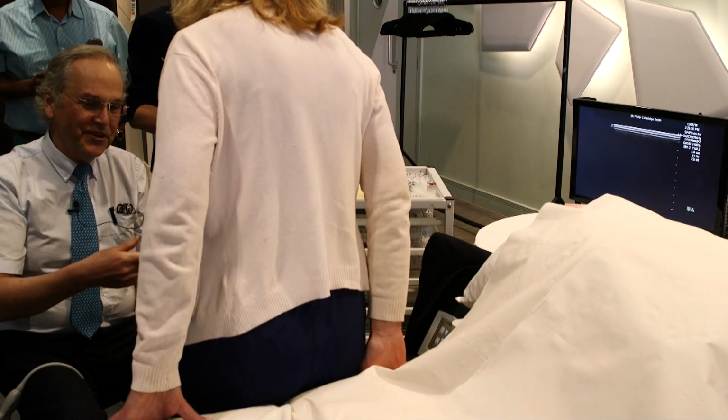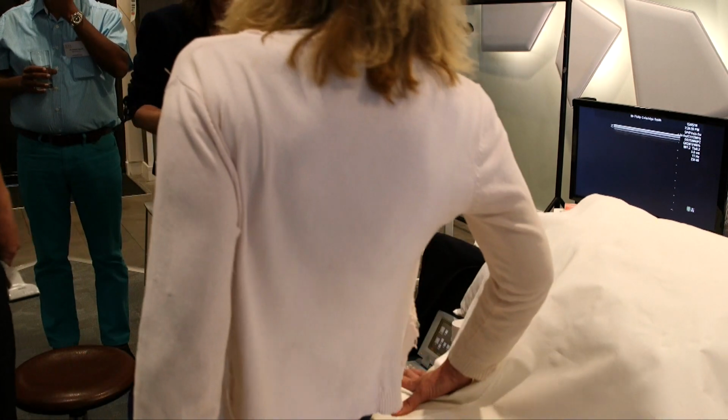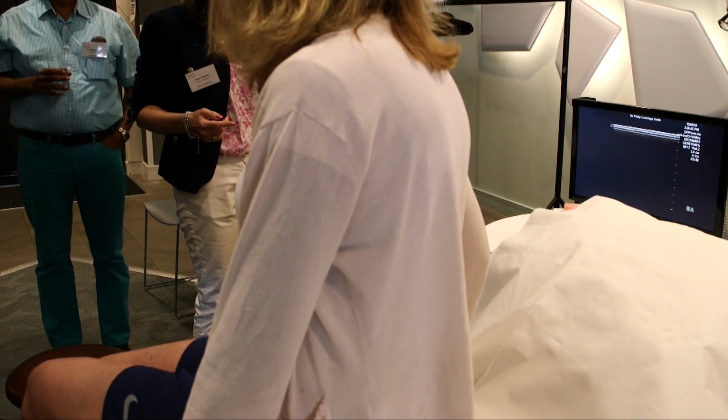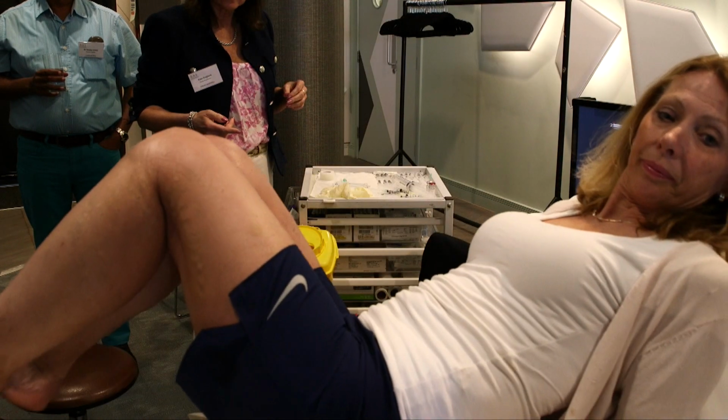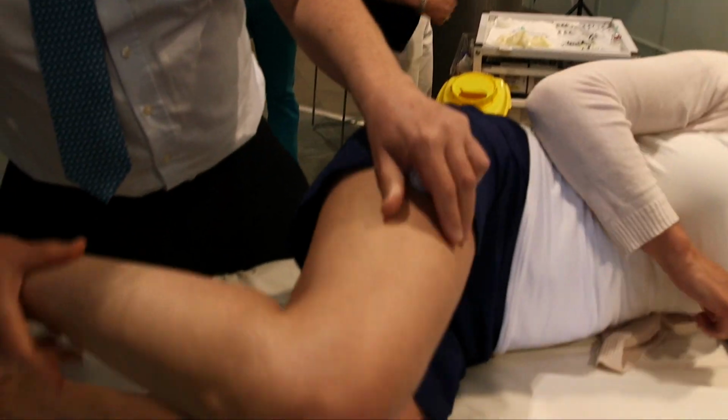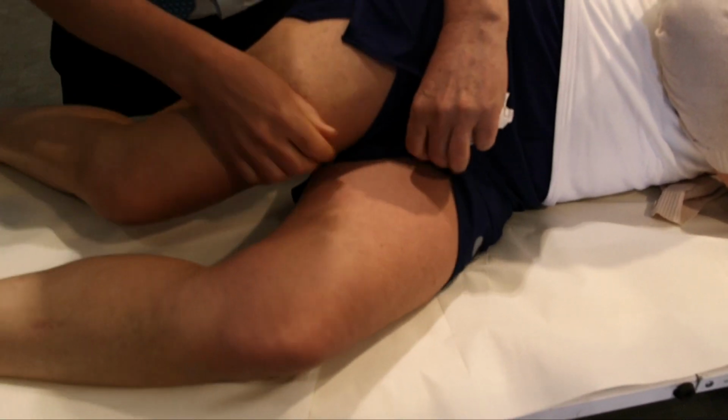Right. Okay, if you can carefully climb on the bed without knocking it over. On my back or side? I think in the first instance, if you'd be kind enough to lie on your side and look away from me, it will hopefully give us the best picture of your leg. So bring this over here and this down here. And this up here. So what I'm planning to do is some injections over there. It's the slightly difficult way for me, but I think this is going to be working out okay.